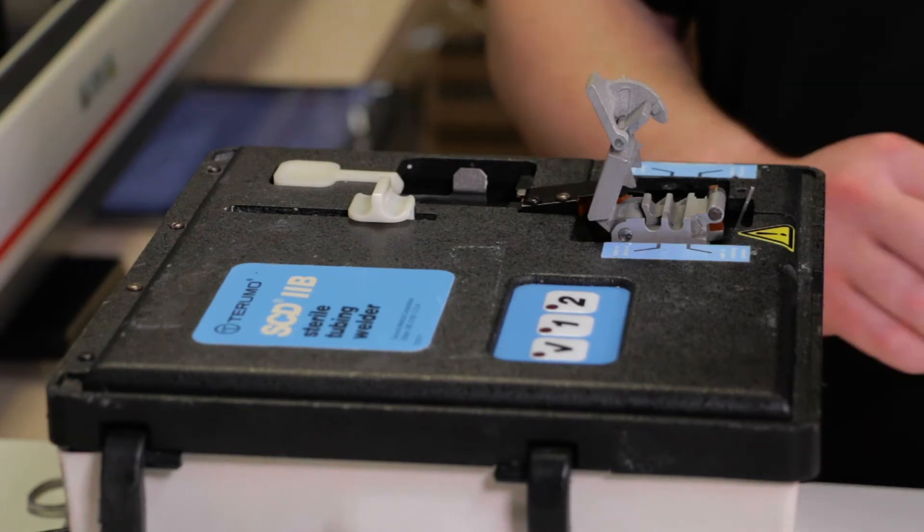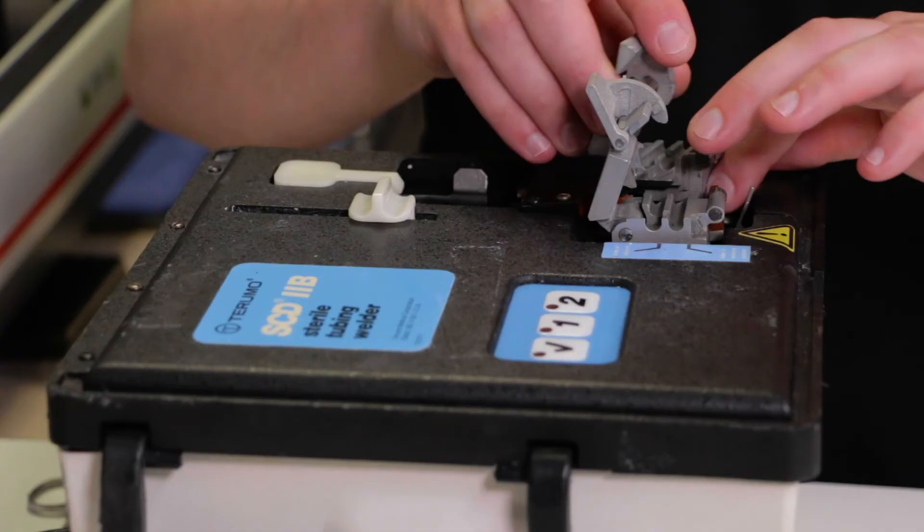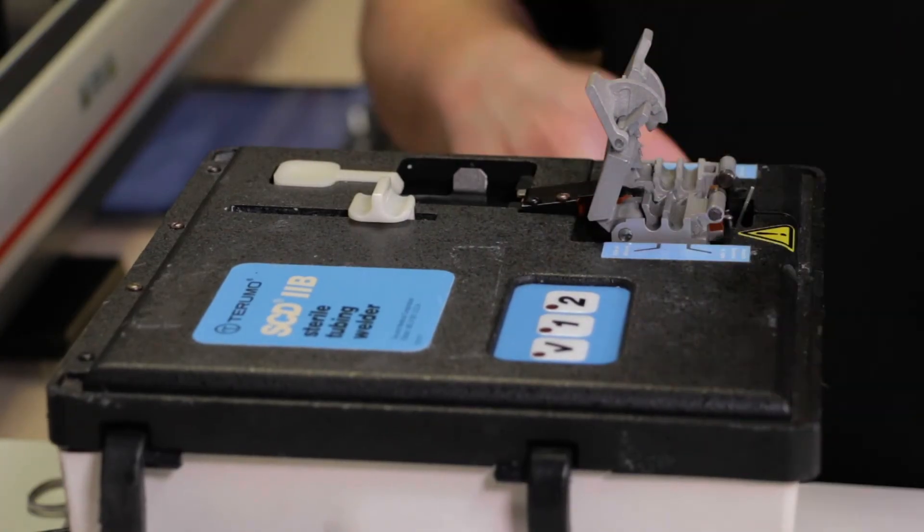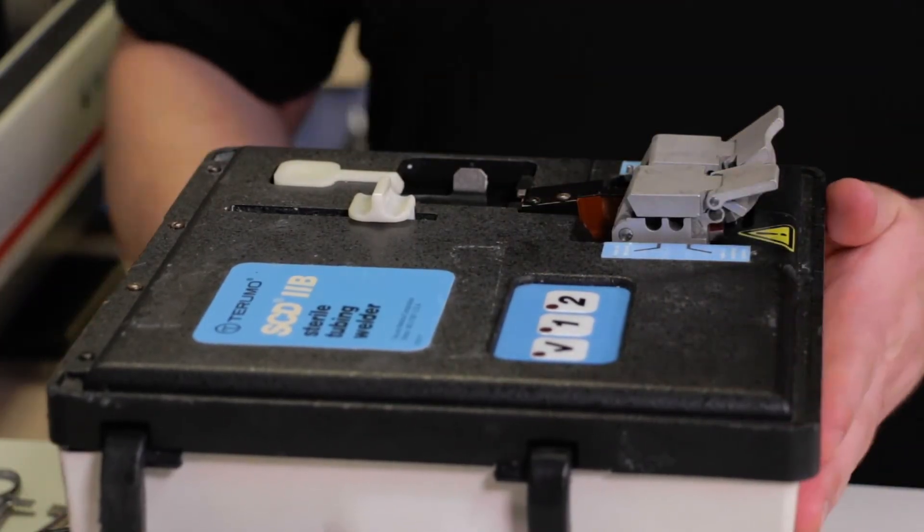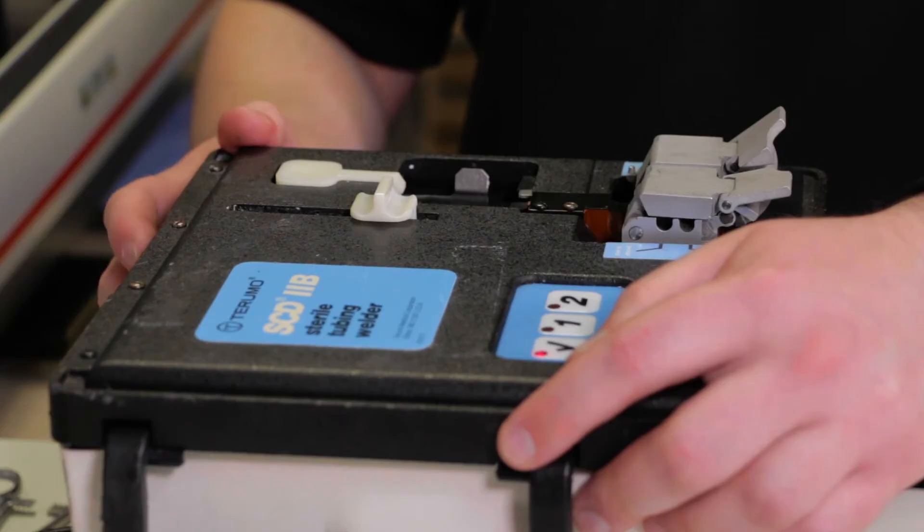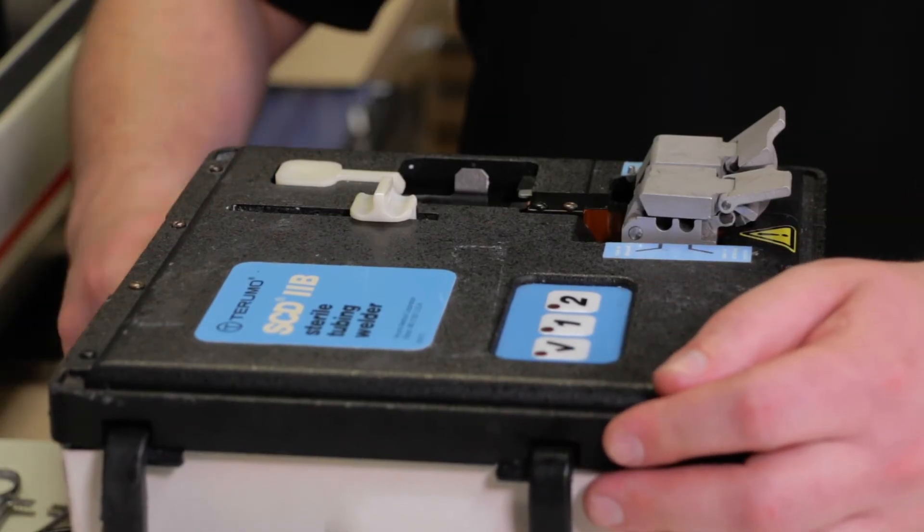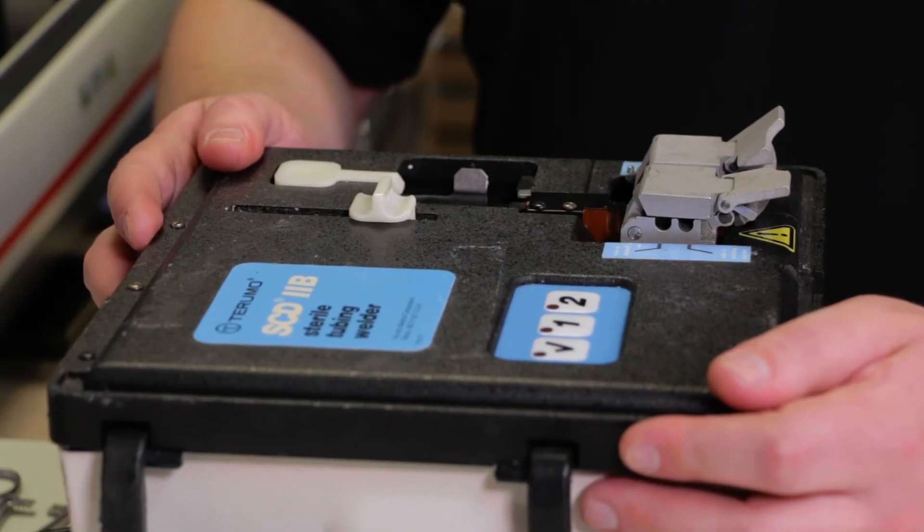Once that's done, simply replace the frame-mounted carrier, re-initialize and home the welder, and follow the realignment steps outlined earlier in this video.